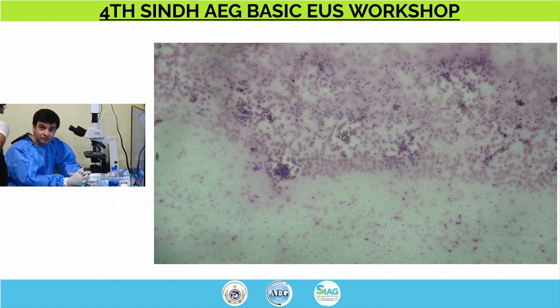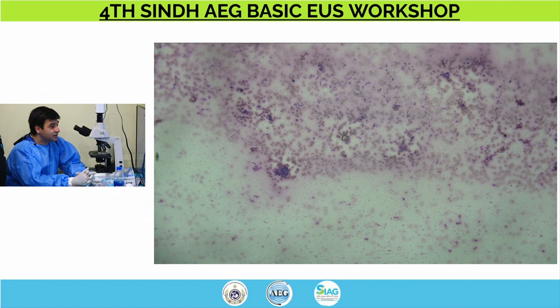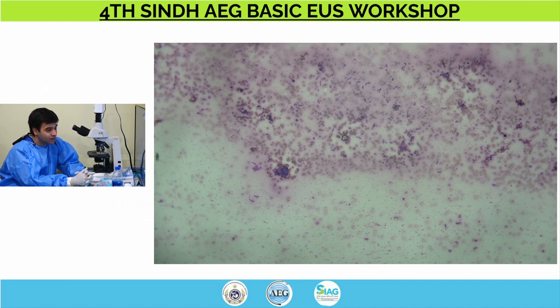Dr. Hassan, what do you think about this? Are there any sort of round cells, or on the other hand spindle type cells that might indicate either a leiomyoma or a GIST? Leiomyoma or GIST you cannot differentiate on just the slide itself. With this staining they have to do CD117 and other staining to differentiate between the leiomyoma and GIST, but I do see spindle cells on there. I do not see any cells which worry me about lymphoma. Now how are you telling the spindle cells from a GIST apart from the spindle cells that you would normally see in any type of transgastric transmural biopsy? What on this slide tells those apart?